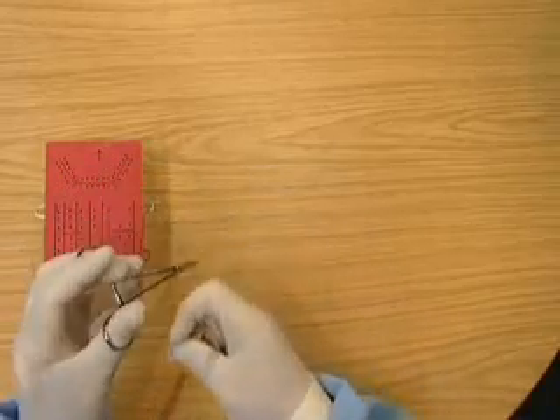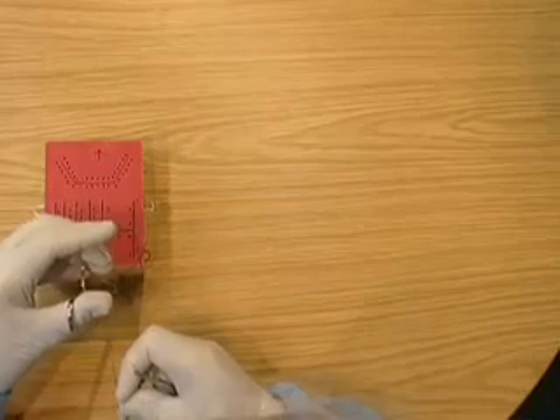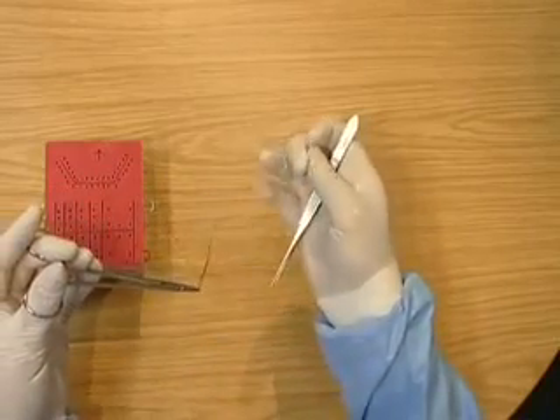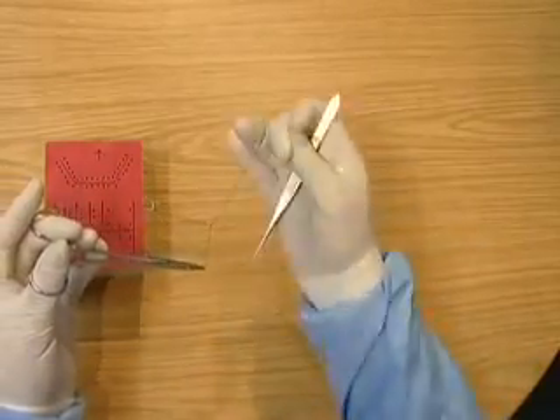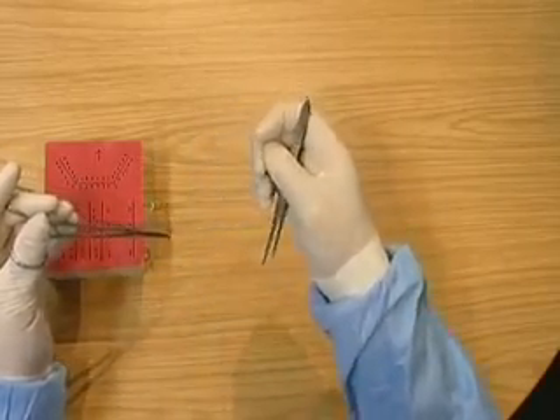Going over, over, and then winding on, running the knot down the thread and using the first finger to tighten the knot.